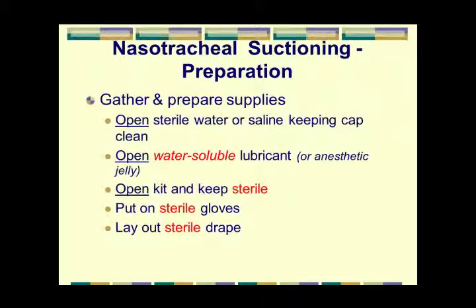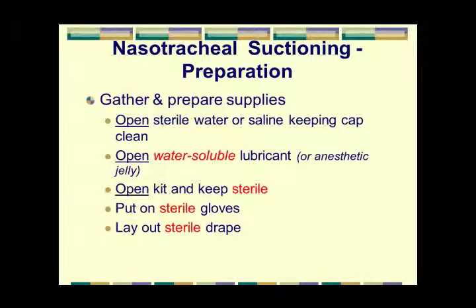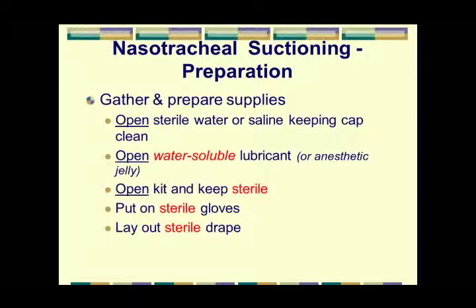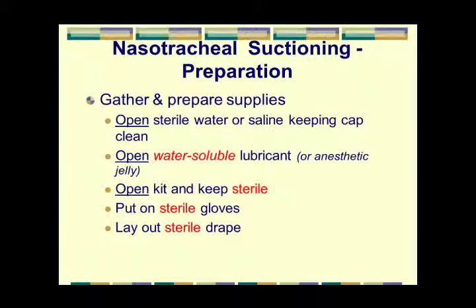I open my kit, keeping it sterile. Keeping it sterile means I don't reach over the kit. I reach from the sides and pull it away from me. Once I have that open, it now is sterile on the inside. I need to maintain that sterility. Put on my sterile gloves.